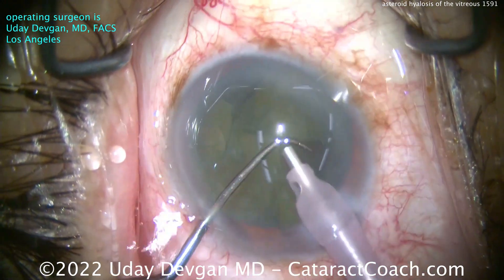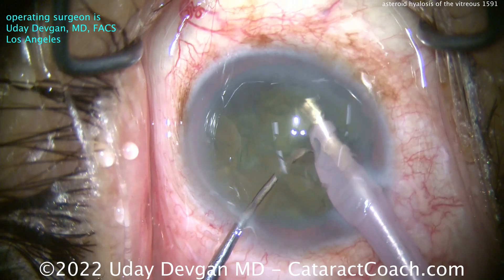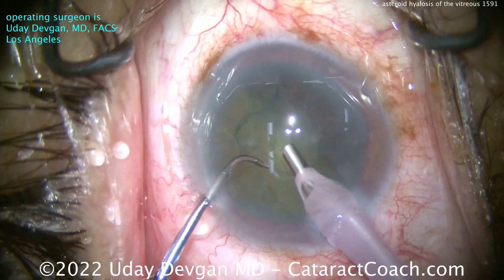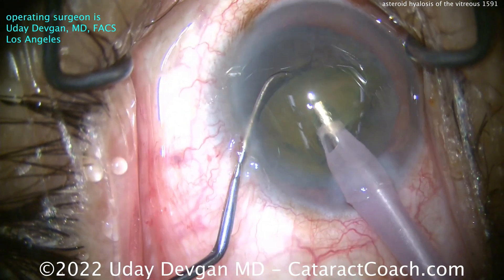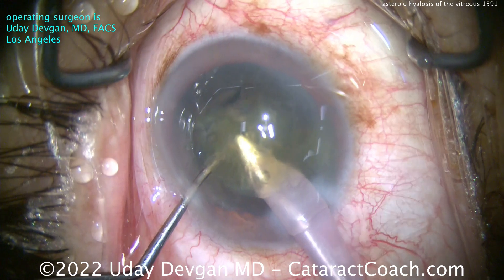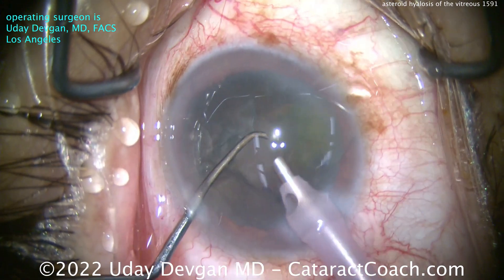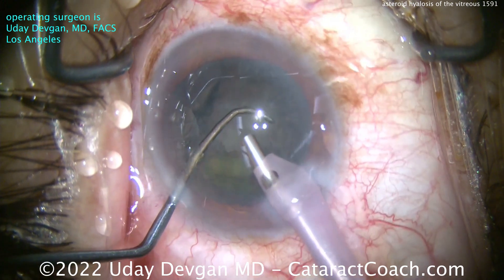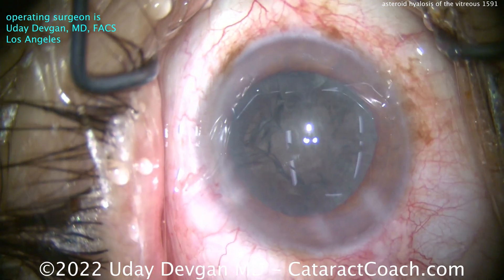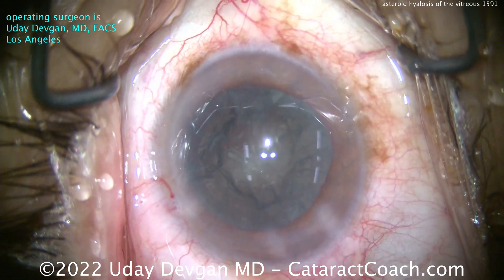You could put in the other choices, but I don't know if you're going to get the same visual or optical performance that you're expecting in an eye without the asteroid. The other question is: a patient like this with one eye having no asteroid hyalosis and this eye having a lot of it — is there some subclinical mild degree of hidden amblyopia? Not big amblyopia, but maybe just a little bit. It's hard to say. We're operating on this patient's right eye and the patient is right-handed, but in testing is absolutely left-eye dominant. In a case like this, I'm going to shy away from any type of light-splitting or light-changing lens and stick to a monofocal.